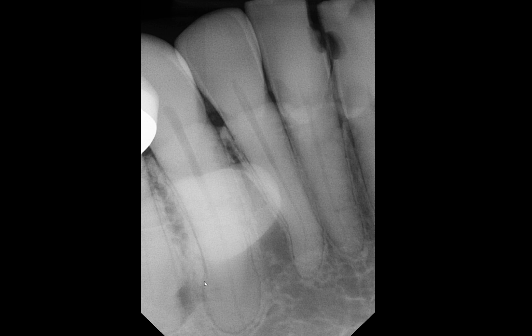This is how hypercementosis appears — it has this bulbous appearance toward the apex of the root. In some cases, it can affect pretty much the entire length of the root as well. How this differentiates from other potential periapical opacities is that because this is deposited directly on top of the root, you don't see any PDL space separating the root from the opacity. It's a gradual transition of the same root material.